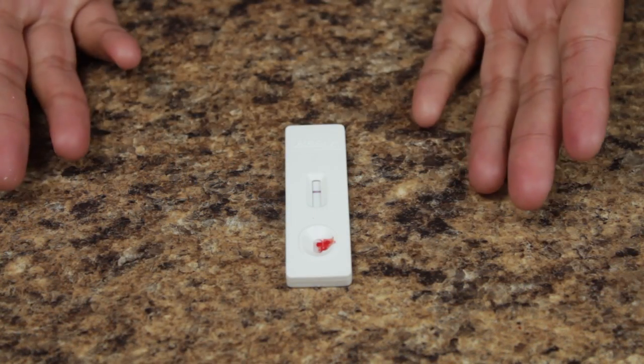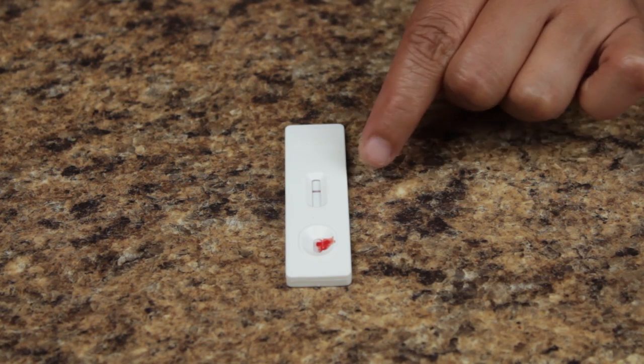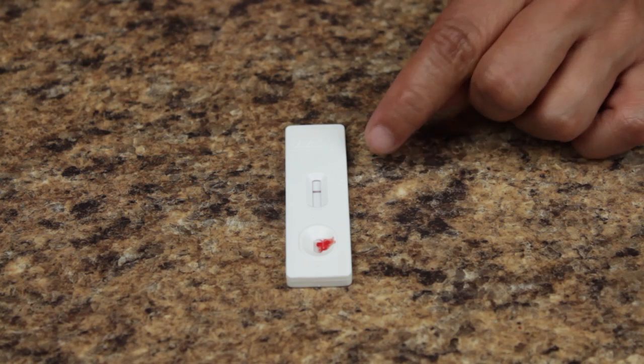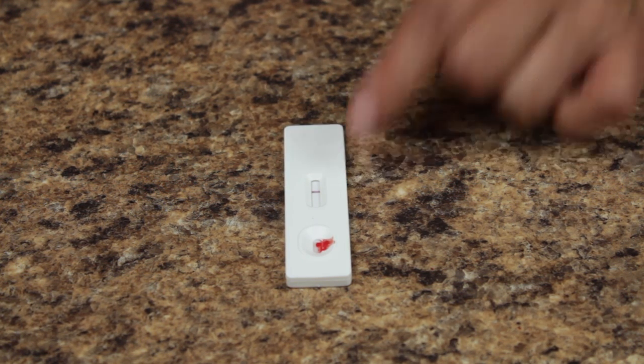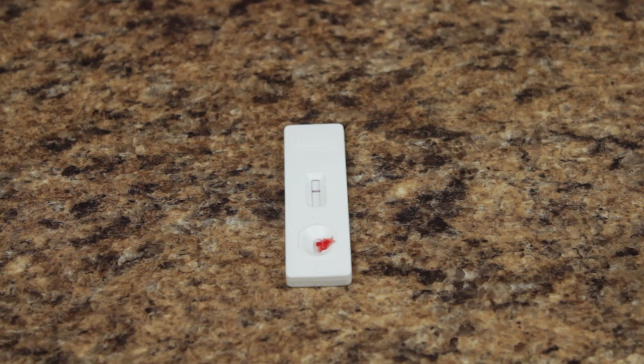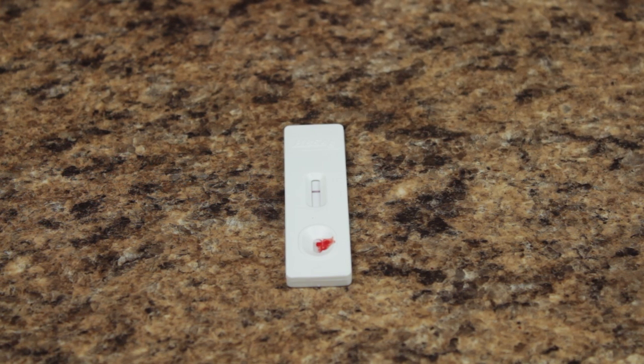After 15 minutes, review the test cassette. Do not read the results after 30 minutes. A single line in the result window at the C position indicates a negative result. A negative result means the sample indicates that you do not have syphilis. Two lines in the result window at the C and T position indicates a positive result.